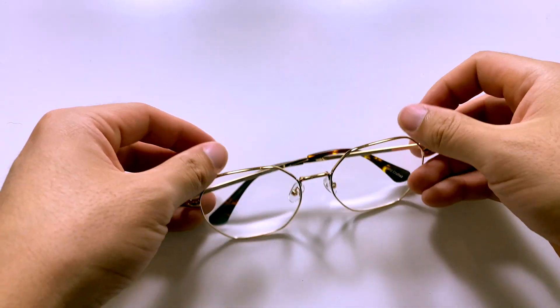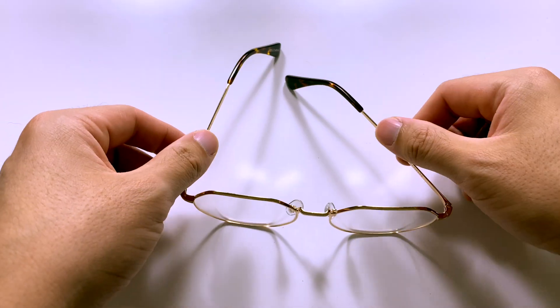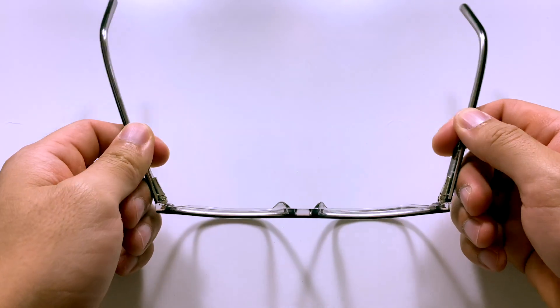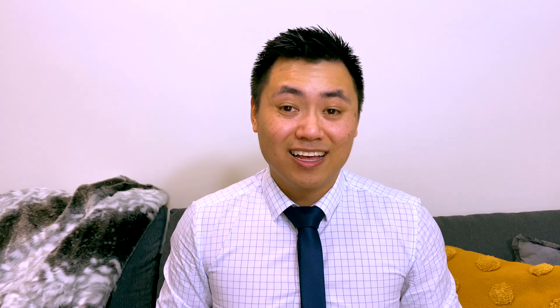Glasses usually come in one of two types of hinges. You can either have standard hinges, which stop when you get to 90 degrees, or flexi hinges, which normally cost a little bit more and allow some flex. The standard hinge tends to last a little bit longer than the flexi hinge. The flexi hinge has a little spring on the inside, and sometimes the spring can become loose causing the arm to fall off. However, the flexi hinge is a lot more comfortable and is less likely to break if you bend them the wrong way. With the standard hinge, if you bend them too far they can just snap off.